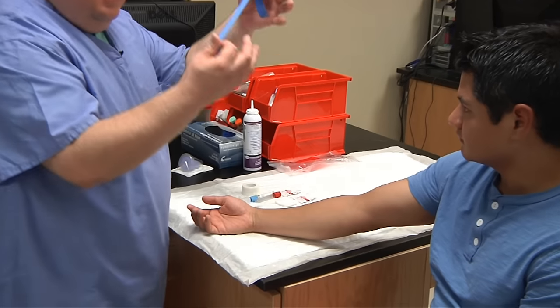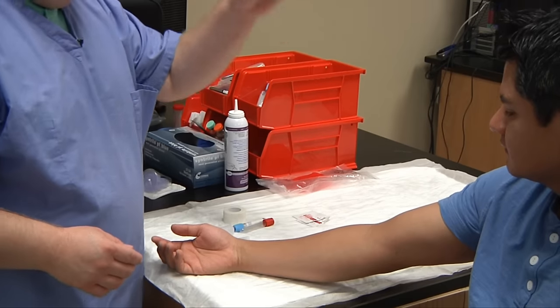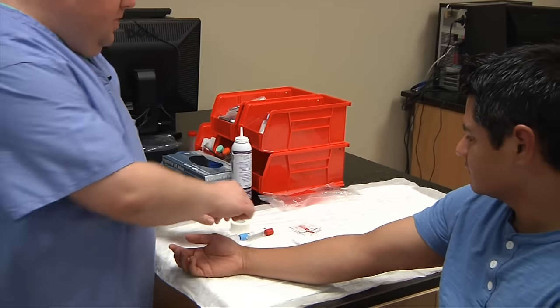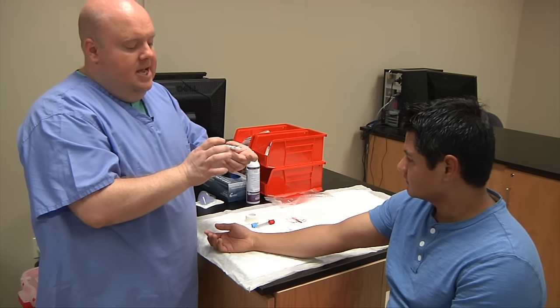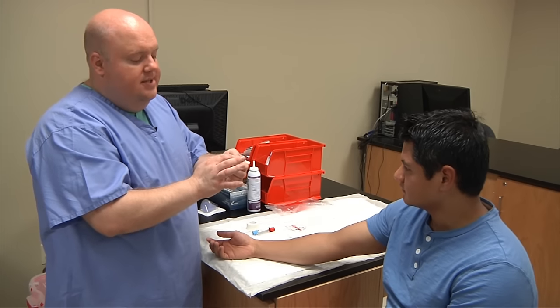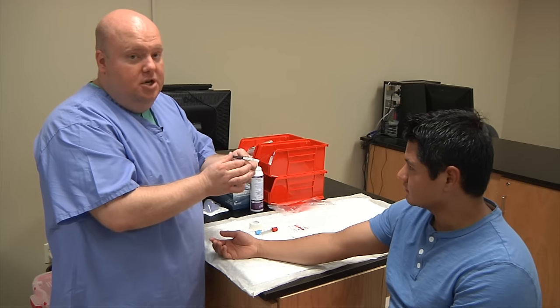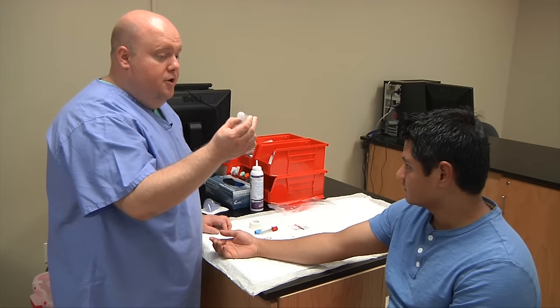The supplies I'll need include a new tourniquet, a couple of alcohol swabs, and a couple of pieces of 2x2 gauze — non-sterile is okay. You'll need your multi-sample needle. Make sure that it is in date and the paper label is intact. This is very important to check every time. If the paper label is not intact and matching up, we do not use the needle. You'll also need your holder or hub.